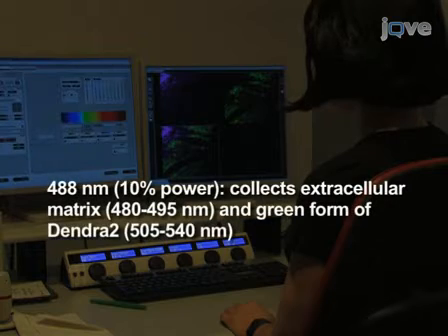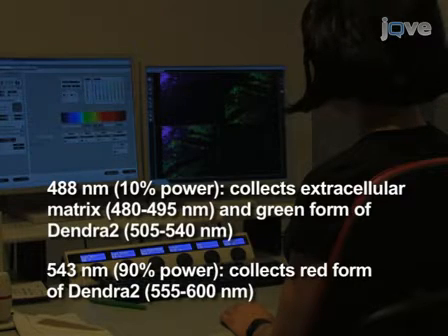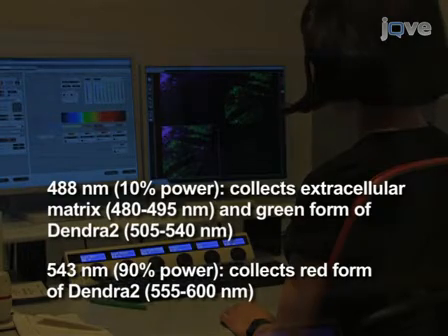One channel uses the 488 nanometer laser line and collects scattering from the extracellular matrix and emission from the green form of Dendra2. The second channel uses the 543 nanometer laser line and collects emission from the red form of Dendra2. Collect 3D images before photoswitching.